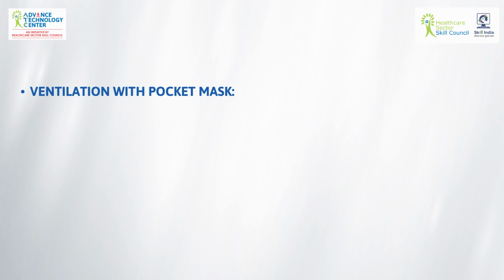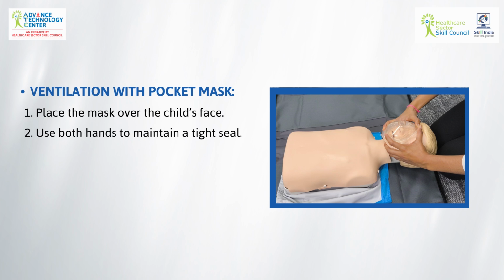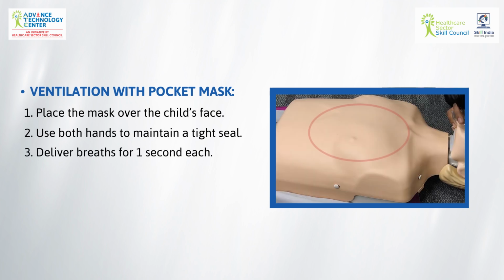Ventilation with pocket mask. Place the mask over the child's face, ensuring complete coverage. Use both hands to maintain a tight seal. Deliver breaths for 1 second each, ensuring the chest rises.